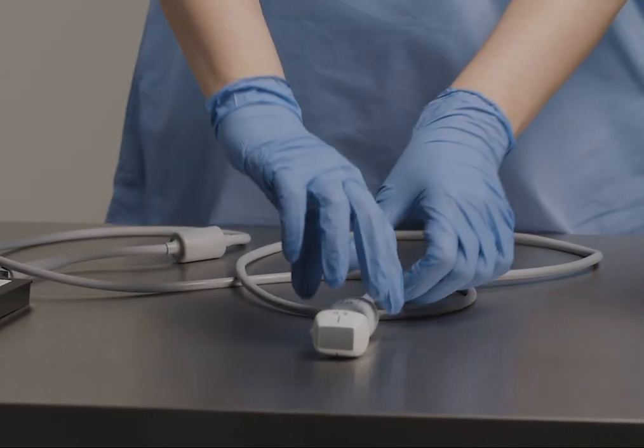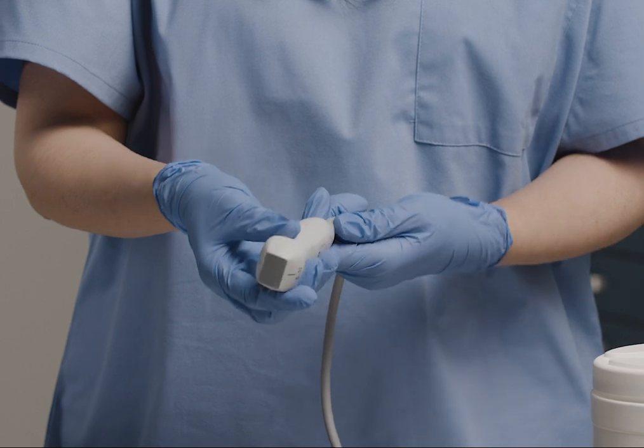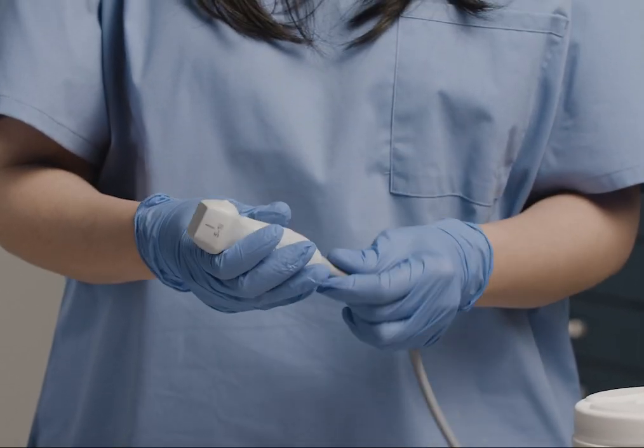Be sure to check the transducer and cable for any visible damage. If you do see any damage, discontinue use and contact Fujifilm Sonocyte for service.